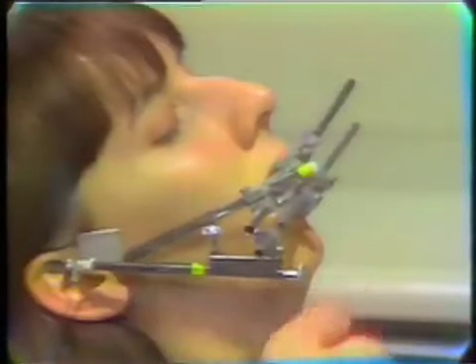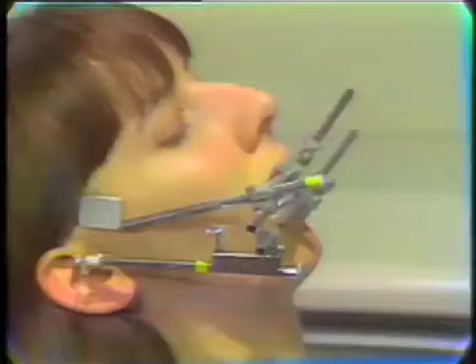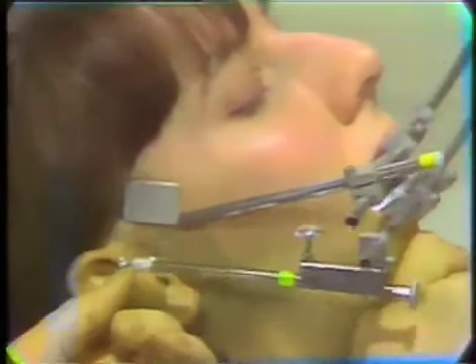Now, if we compare this with what we had on the arbitrary axis, we can see how close the arbitrary axis is. So let's move the flag away and see where the point came in relationship to the arbitrary hinge axis. Open and close, please. Now you can see the difference between the true hinge axis point and the arbitrary axis point. In this case, we are down and back from the arbitrary axis. And later on in the demonstration of the effect of the hinge axis, we'll see what effect this would have on the closure on the articulator.